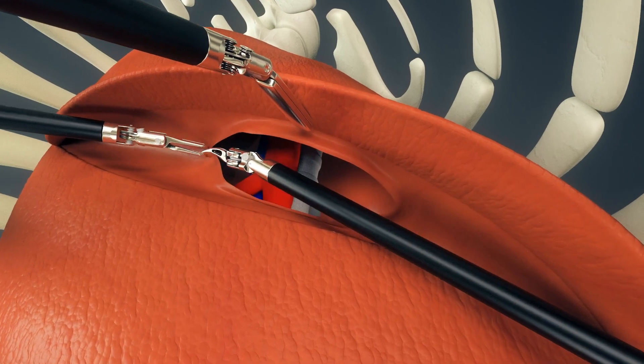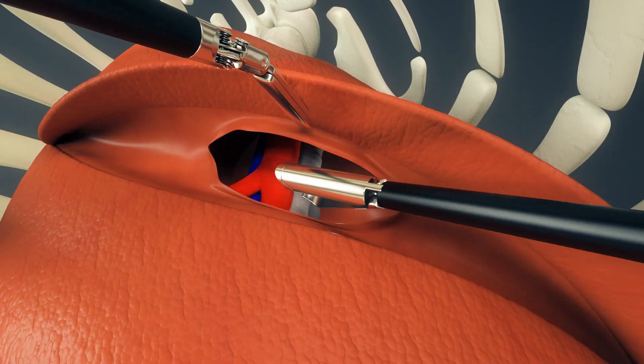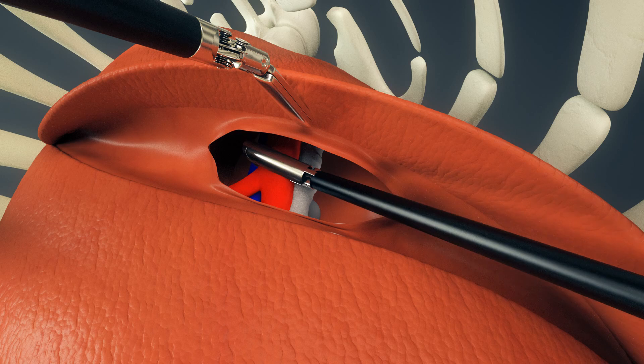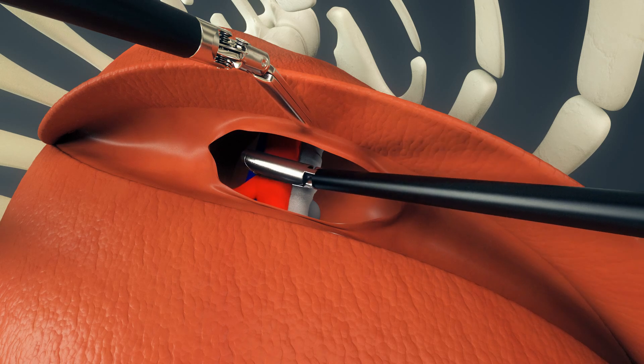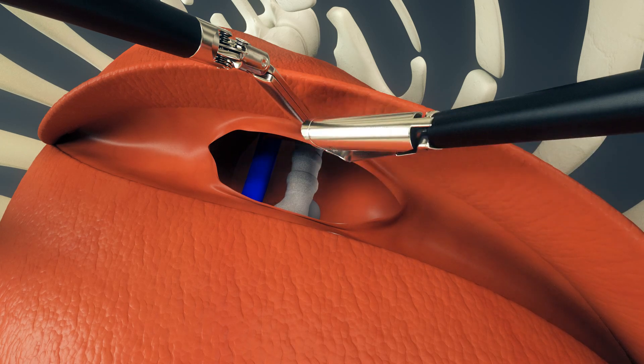The surgeon has a right-handed instrument, a left-handed instrument, and a third accessory arm for extra retraction. Using the third arm, the surgeon lifts the lung, thus exposing the pulmonary artery, the pulmonary vein, and the bronchus.